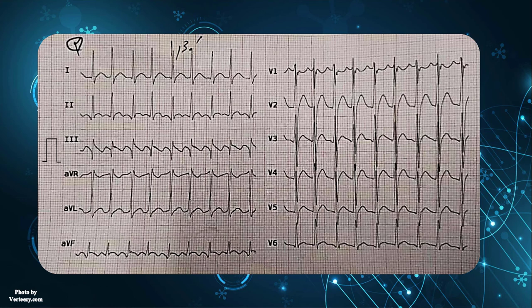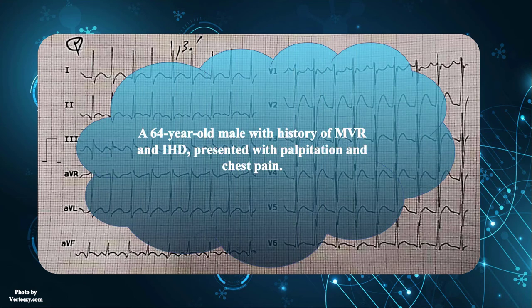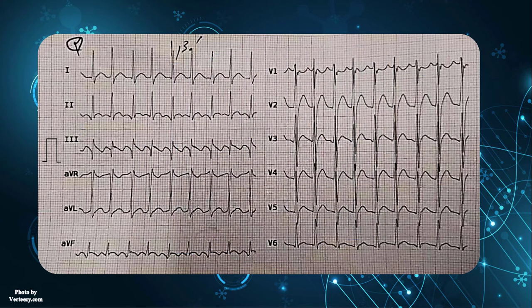The present EKG is obtained from a 64-year-old male with history of mitral valve replacement and ischemic heart disease, presented with palpitation and chest pain. On physical exam, he has tachycardia and the hemodynamic is stable. What do you think about this strip?